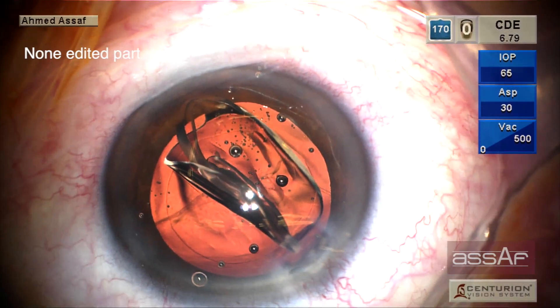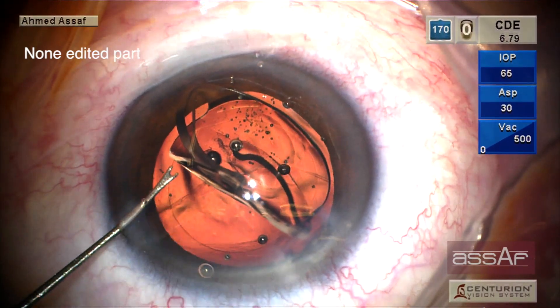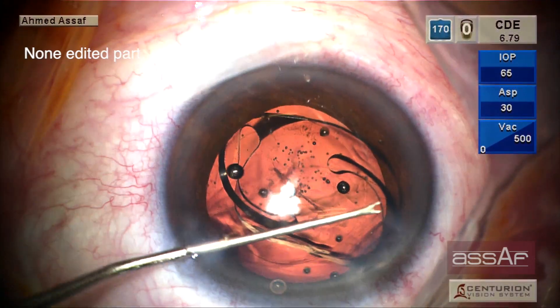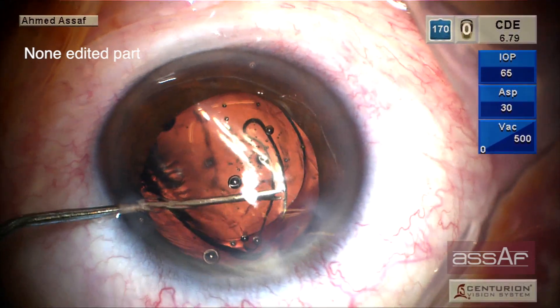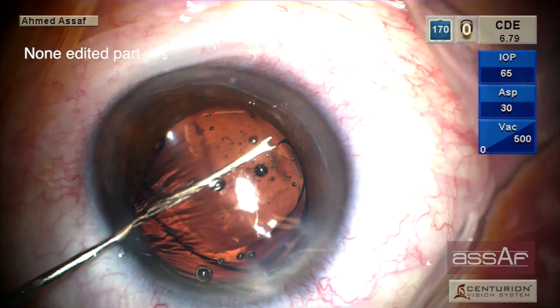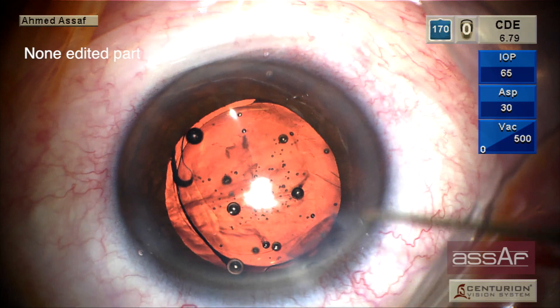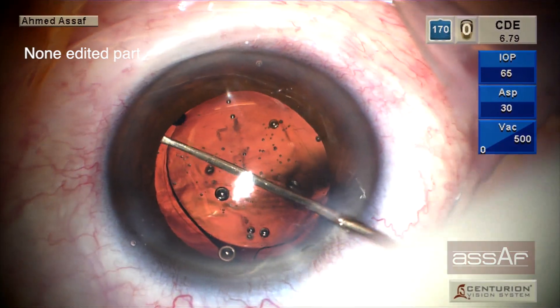As you can see, I have implanted the lens inside the anterior chamber, and taking advantage of the slow unfolding of the hydrophobic acrylate lens, I could manipulate the lens so that each haptic would unfold in the area of presumed maximum support from the torn posterior capsule.